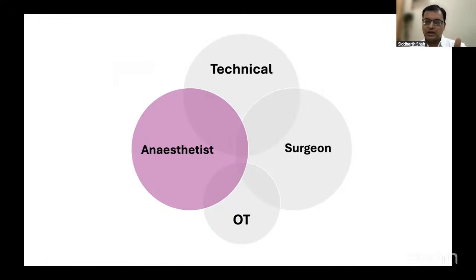But then we are looking at the factors. What's the blood loss? What's the pH of the patient? The anesthetist is going to run a new ABG at that point of time. What's the temperature of the patient, because hypothermia can lead to an alteration in signals? Was there any recent inhalation or IV agent given? All of these aspects are usually checked first, because these are the very sensitive points which can easily be corrected, especially your blood pressure and the temperature, which need to be looked at.